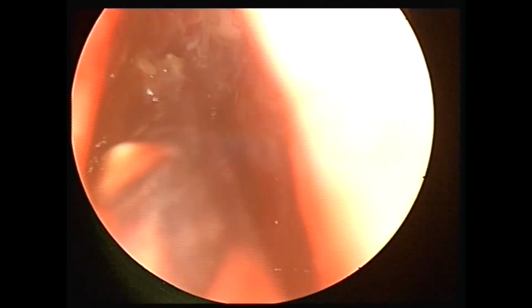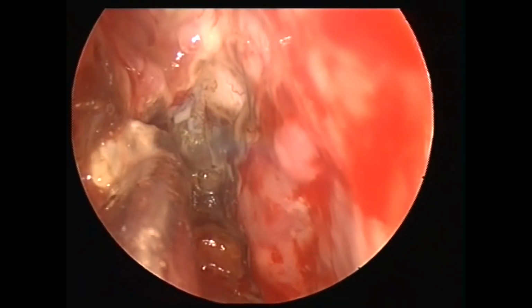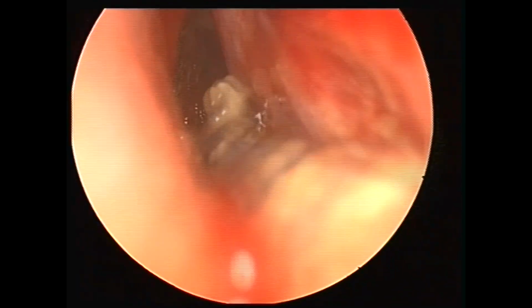You've got to use liquid paraffin. You've got to keep giving multiple liquid paraffin washes. Right now the scab is present all over the skull base, so I don't want to take any chance and break the bone on the skull base. Now I'm trying to change the endoscope.